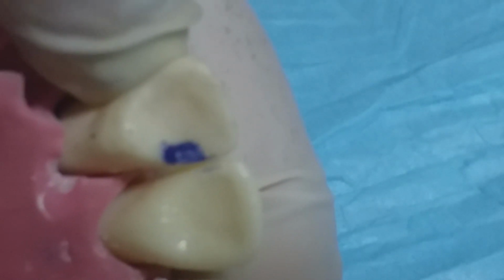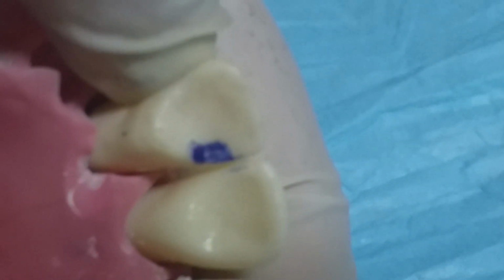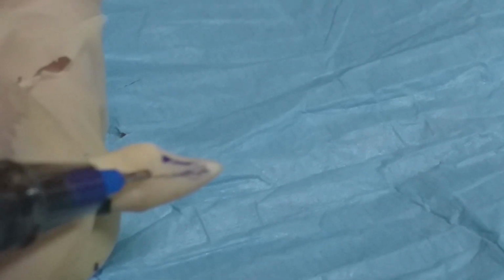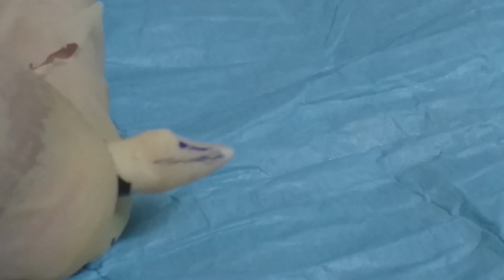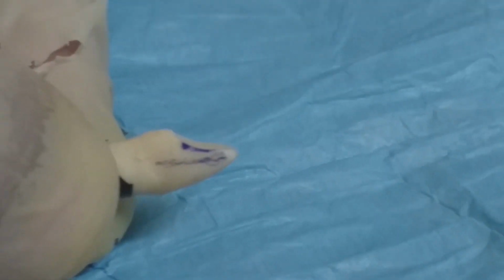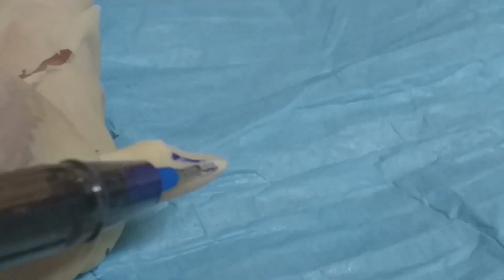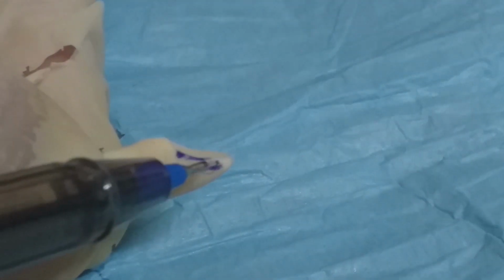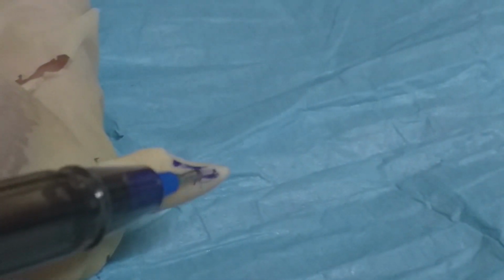This is the outline from the lingual surface, now what we will draw from proximal. We will draw a proximal line like this, and the facial extension, facial depth of preparation will end at this line. This is the proximal line of the contact, it will end at it like this.